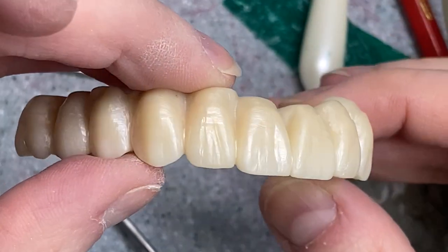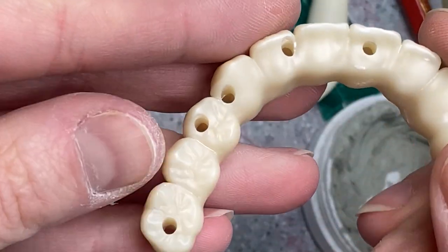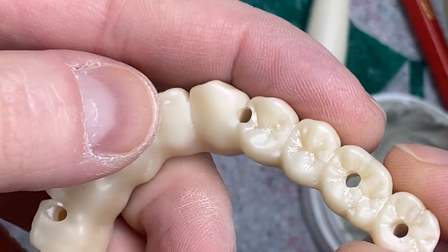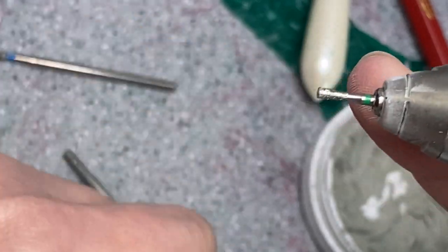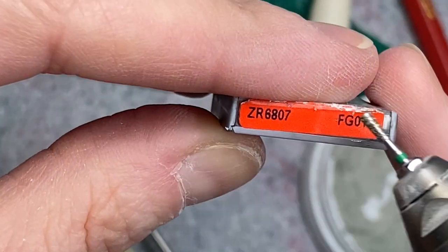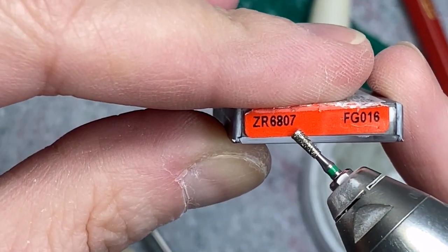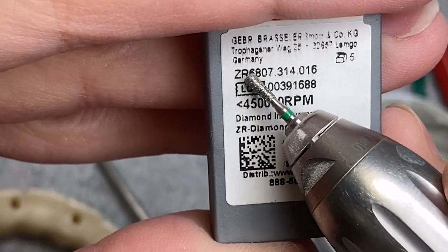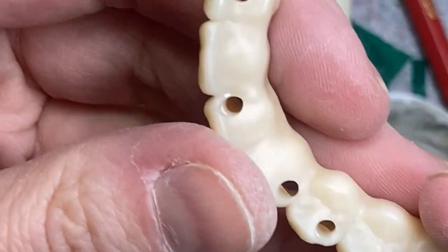Okay guys, so this is it — I did the rest of the bridge. Now you see how it is over here, not very defined. So I defined it much better, and I'm gonna show you now with what. It's this burr — this is the package, this is the number: FG016. And that's what it looks like in the back. So with this we're gonna grind a little bit.